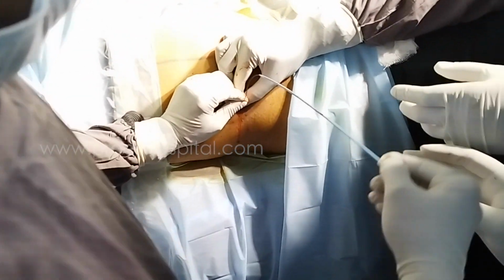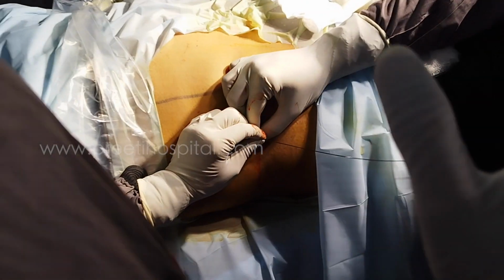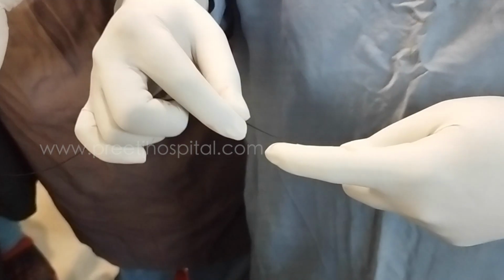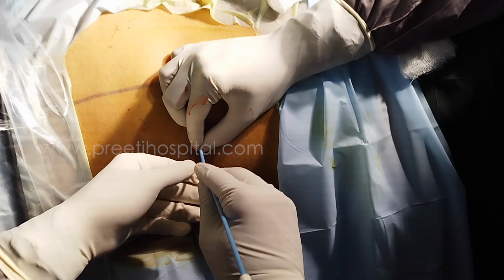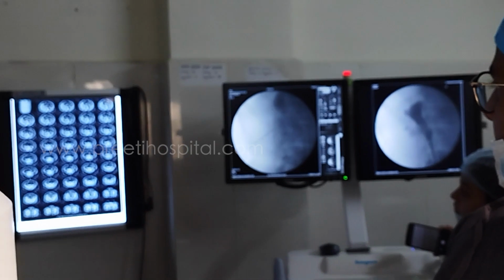The advantage of this is it will bend along with the guide wire, and it will not kink the guide wire. It will take the route of the guide wire. This is also seen with the cobra guide wire. Cobra is also like that. What happens? It perforates the rectus sheath. The ultimate aim is what? You are perforating the rectus sheath, not the kidney. For the kidney, dilatation is not required. This is only for the rectus sheath.